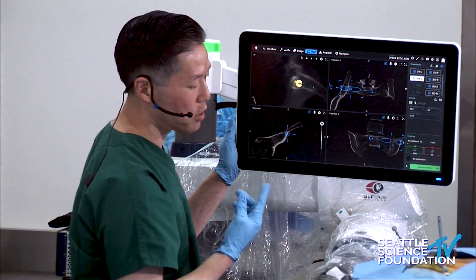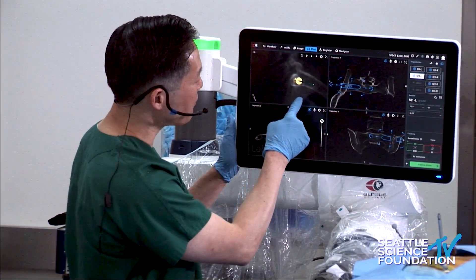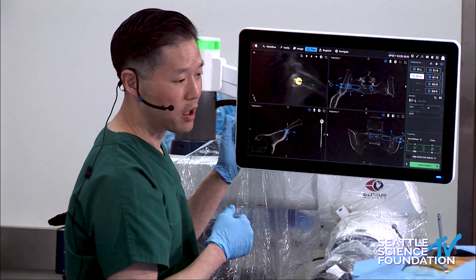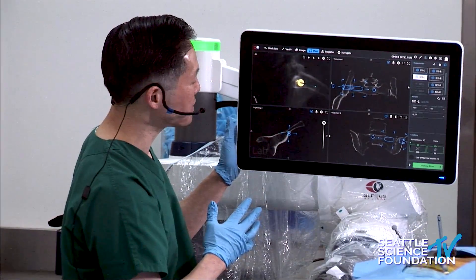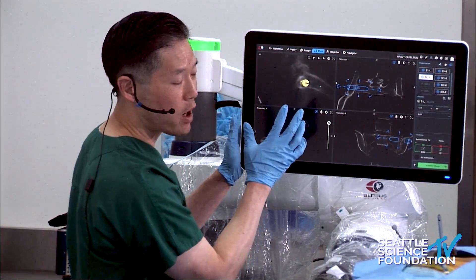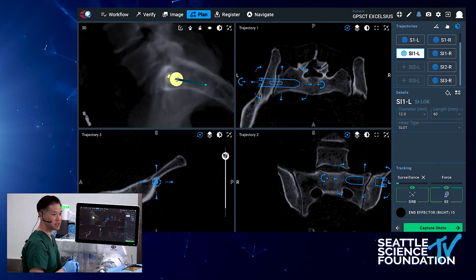For people who don't do SI joint fusions, typically we try to place three screws. The classic teaching with fluoroscopy is to plan the screws so they don't enter the pelvis, because the L5 nerve root rests right on the SI joint as it exits the foramen. One of the risks is if you're too ventral, you could injure the L5 nerve root. That entails a lot of fluoroscopy, which you can avoid with this robotic system.